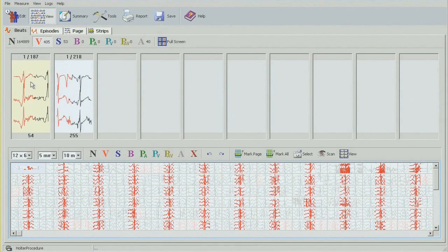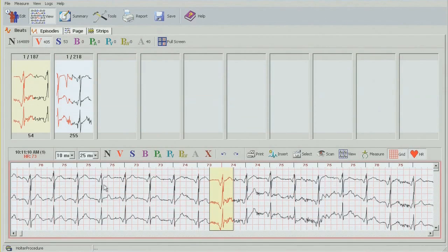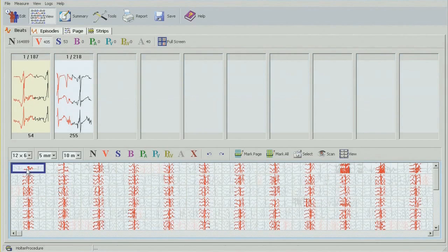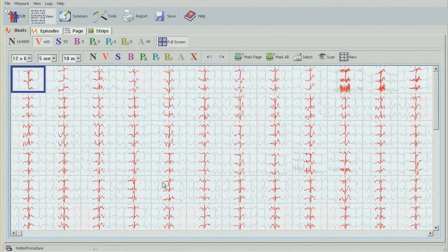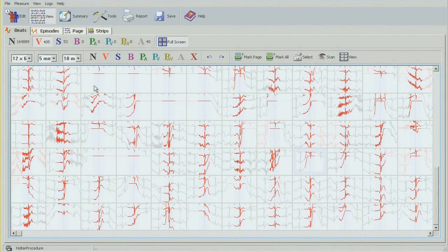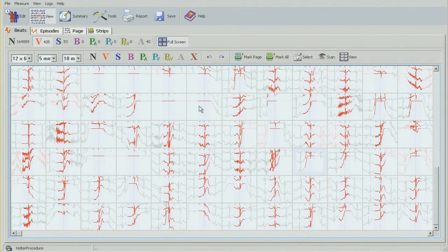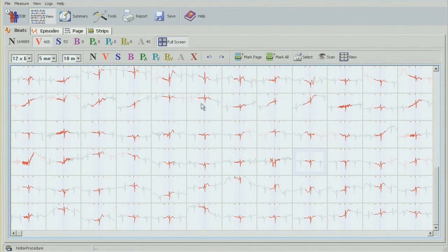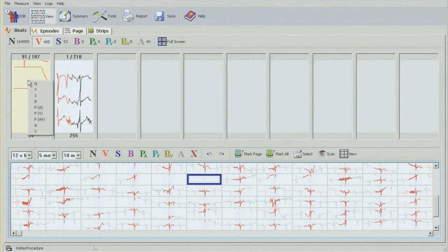Next I'm going into bin number two — same idea using the View and then the Z button. All these beats seem to be normal. There's a bit of wandering baseline here, so I'll toggle between the channels by double-clicking the right mouse button, which takes me to the next channel. All of them are clear here, so go out again using the Z button, right-click, and change them to normal.